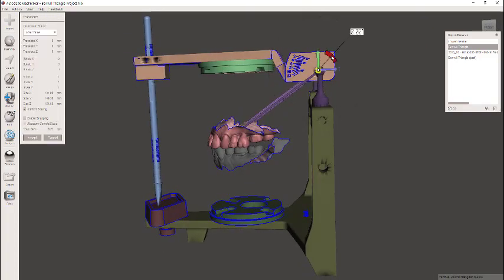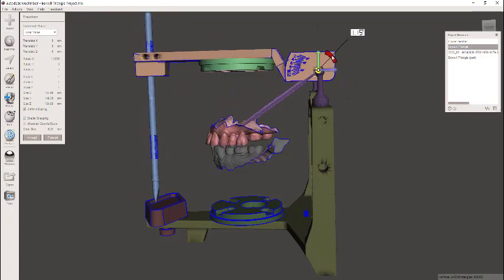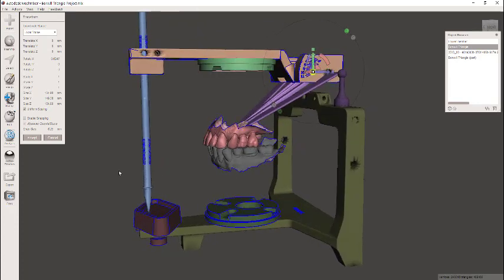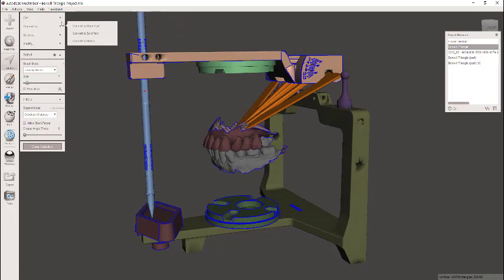You can actually hinge from up here, okay? And that's what you're accustomed to seeing with an articulator. Well, we needed to be able to do that digitally. I know some of the softwares, 3Shape, exocad, they already have this mechanism. Currently, Blue Sky does not have it in the current release, and so this is just something you can download. You can use it in Meshmixer, and really, even if you have 3Shape and exocad, it's kind of a big deal to launch a case and open up all these models and then apply the articulator. This is just something really simple that you could open and within 10 seconds make those changes. So let me separate these back out and then show you how this thing works.